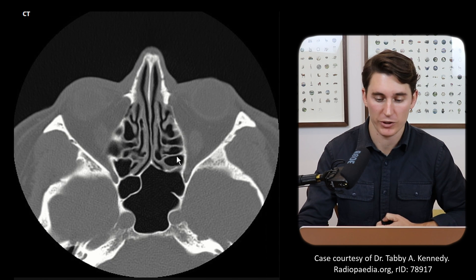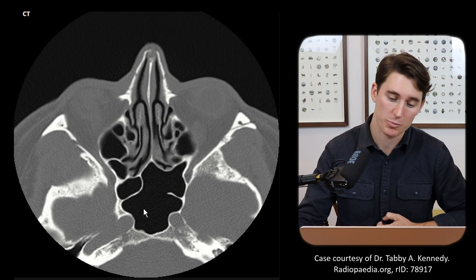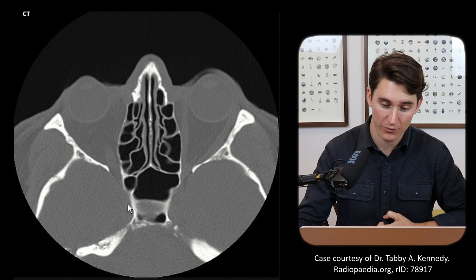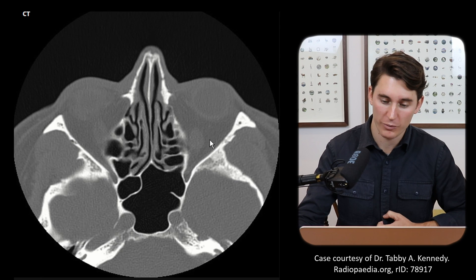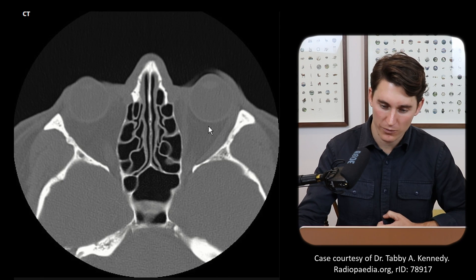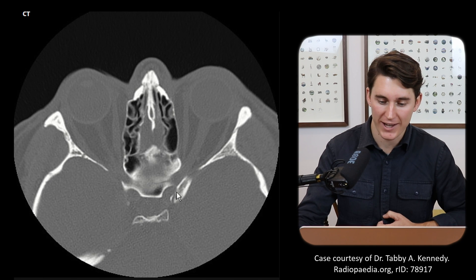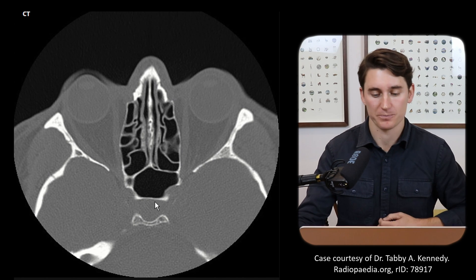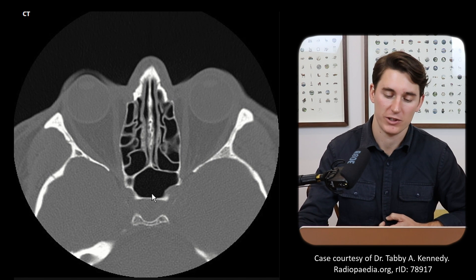Let's look at the axial window. You can see how the carotid is in close proximity to the sphenoid sinus. Scrolling further, the carotid canal comes forward into the cavernous sinus. We can see our sella turcica, and following the optic nerve back we can see into the optic canal — coming just superior to our sphenoid sinus. Here are our anterior clinoid processes, posterior clinoid processes, and sella turcica, which contains our pituitary gland. There is very little space between the pituitary gland and our sphenoid sinus.